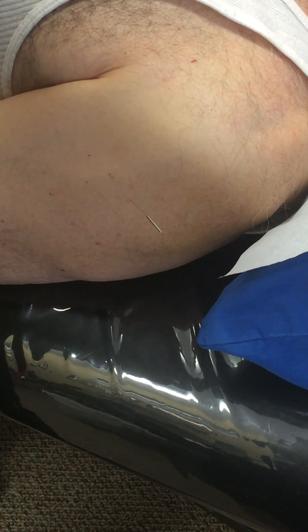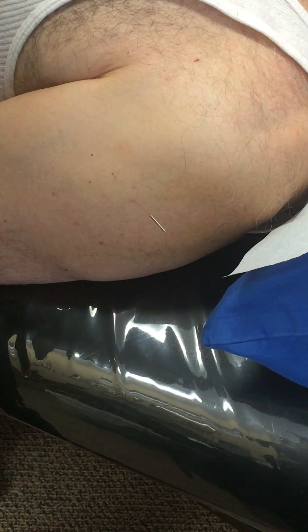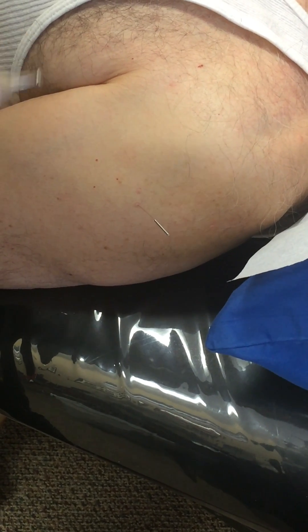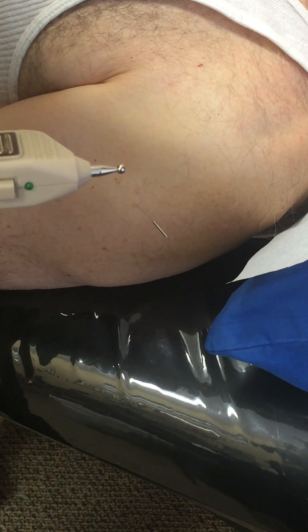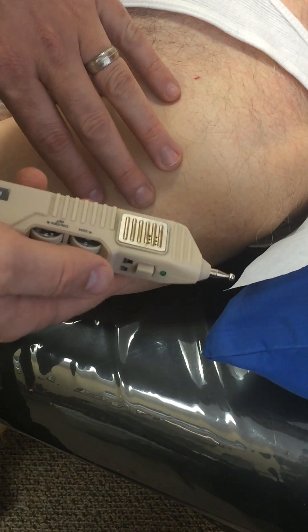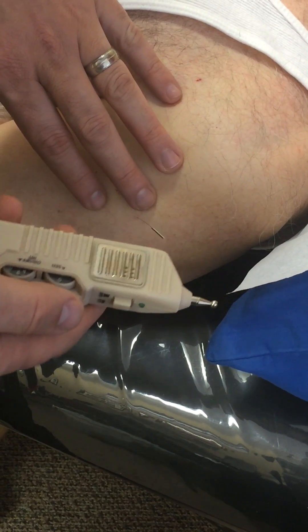I'm demonstrating the hand position of your non-dominant hand when using the Pointer Plus in electroacupuncture. The key is, once the needle is inserted, to pay attention to what you're feeling. This is my left hand — my non-dominant hand — and this is the right hand where I'm using the Pointer Plus.